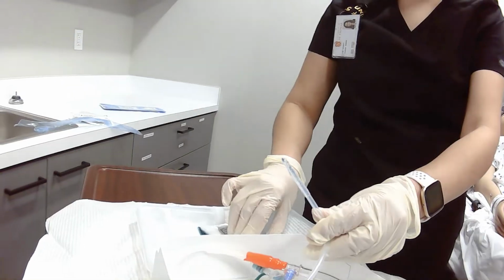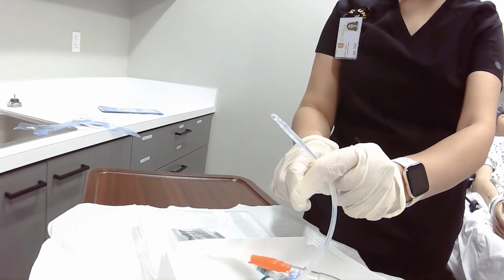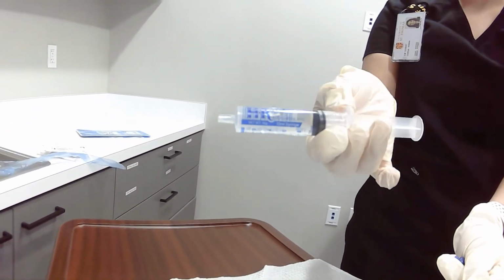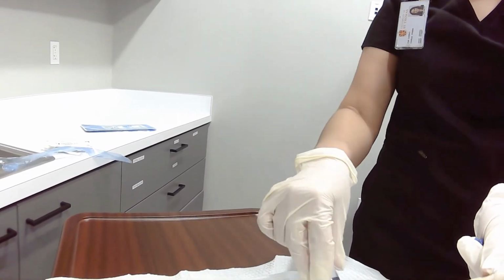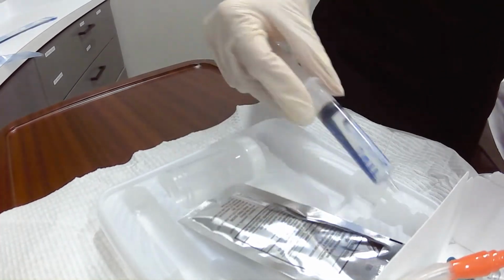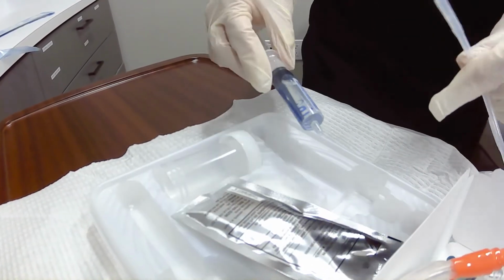So for this next step, I am going to get the lubricant. Again, depending on what your kit looks like, your lubricant might be in a syringe, or it might be in a little lubricant packet. So I'm going to spread the lubricant on the tray here, okay? I'm just simulating it for you, but it's going to go in the tray.